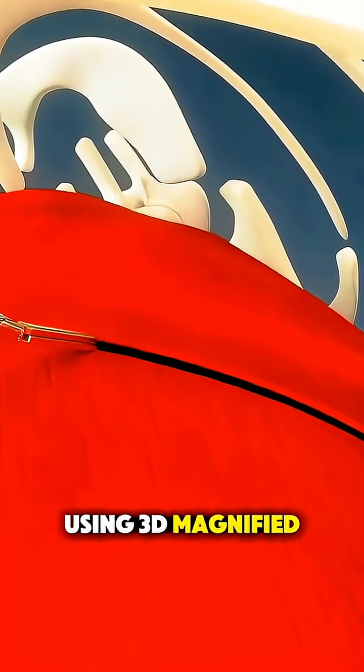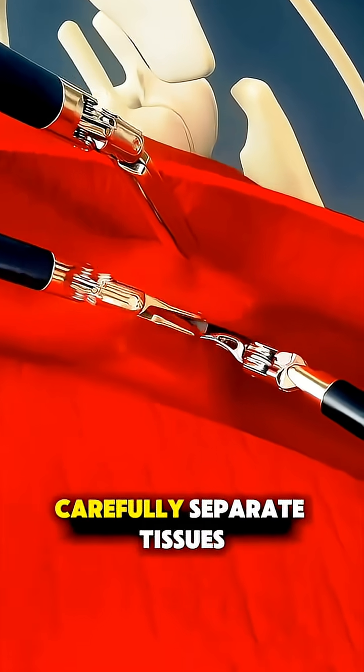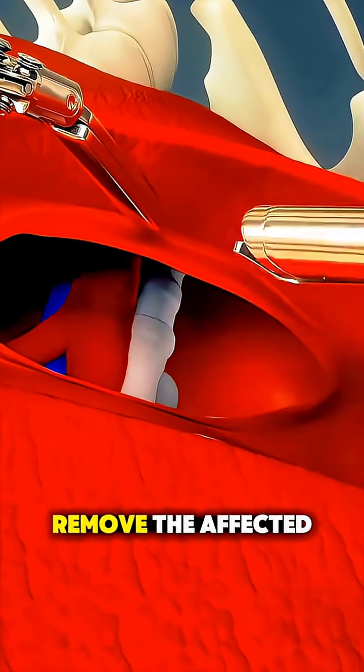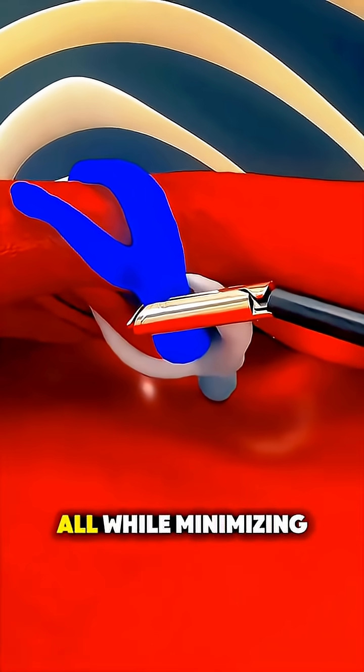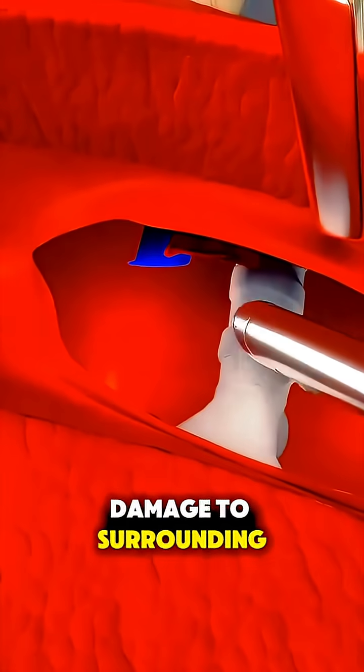Using 3D magnified views, the surgeon can carefully separate tissues, remove the affected part of the lung, and seal blood vessels with unmatched accuracy, all while minimizing damage to surrounding areas.